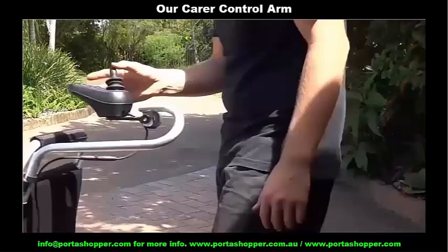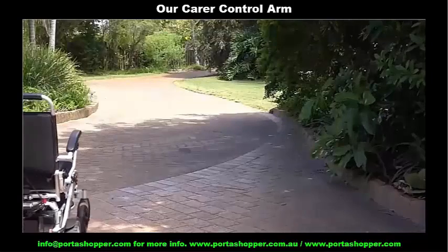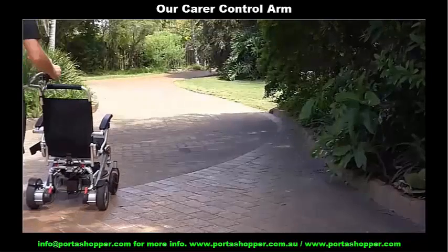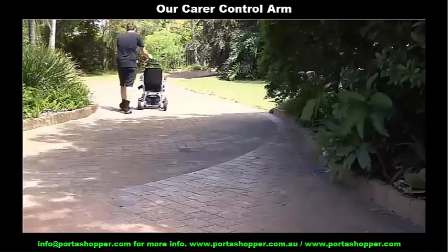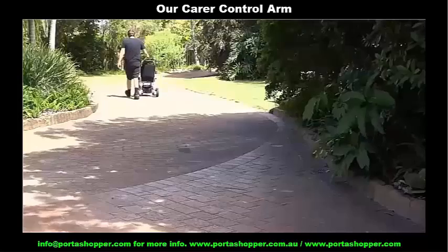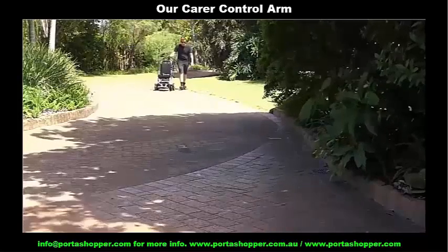Another innovation we include is our carer assist arm, consisting of an extension arm for the joystick that allows a caregiver to steer and power the wheelchair whilst comfortably walking behind it. This is for those instances when the operator loses the dexterity or ability to control the wheelchair by themselves.